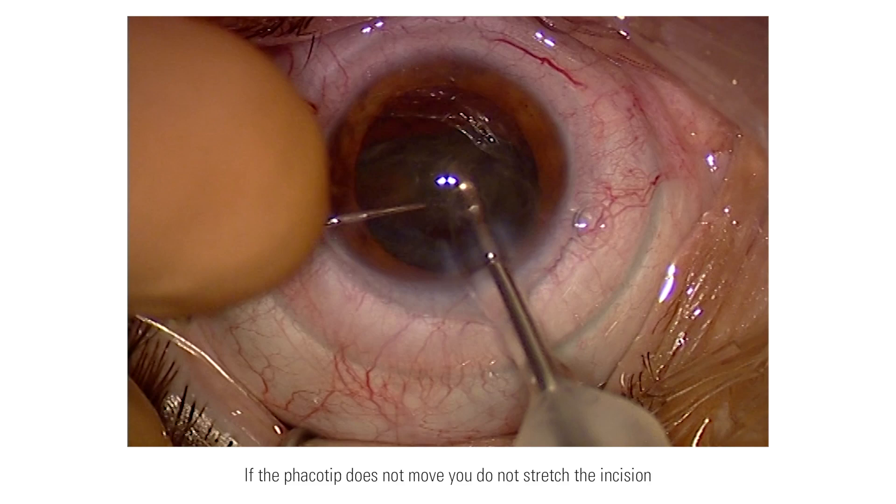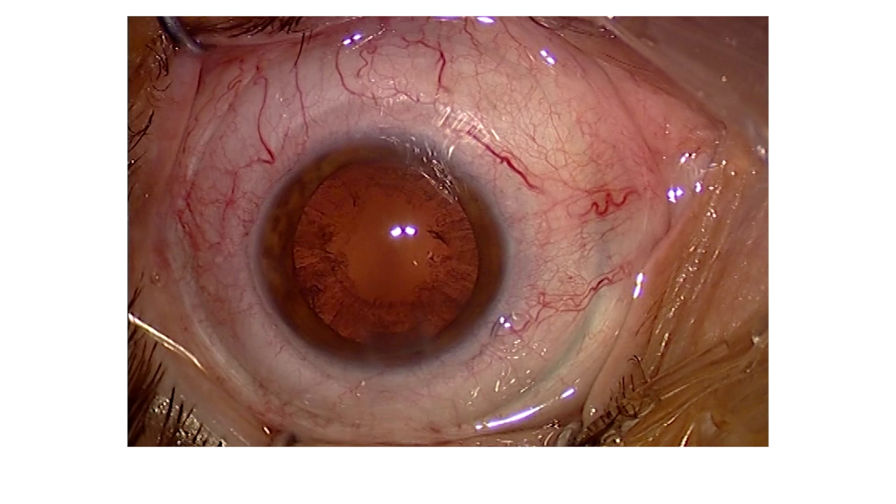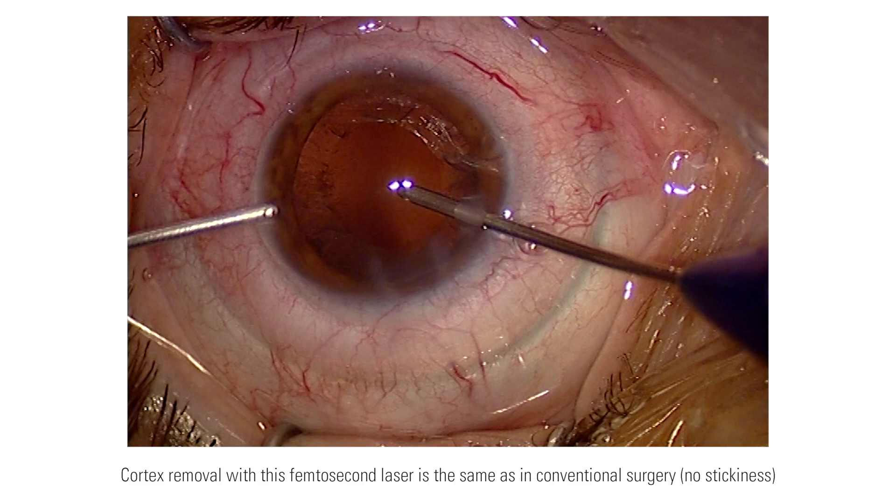I use disposable instruments during the irrigation and aspiration process. When I am aspirating the cortex, I do not feel a difference compared to a conventional case. This might be because of the low energy the laser applies, so there is no stickiness.